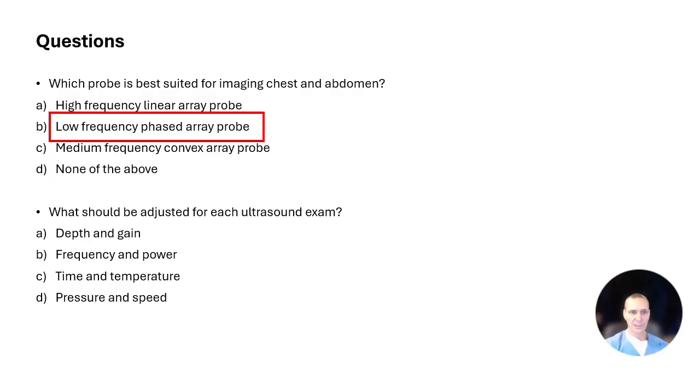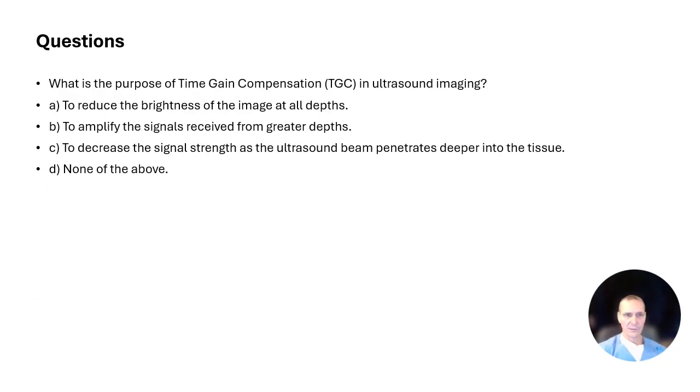What should be adjusted for each ultrasound exam? A, depth and gain, and that's the answer. Always, always, always think of your depth. The most common mistake I see when people aren't getting the image they want is their depth is not set correctly.